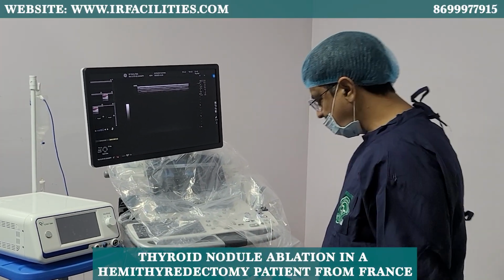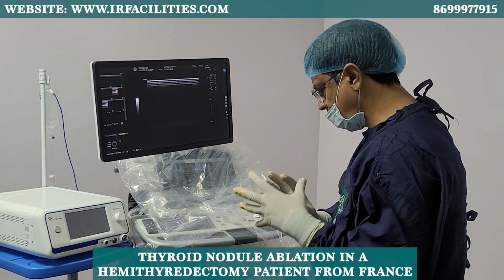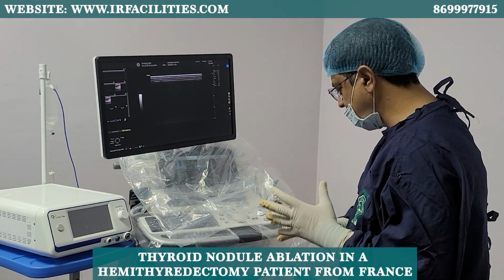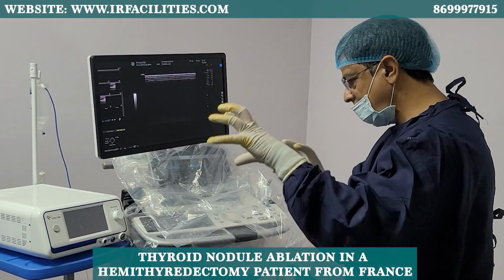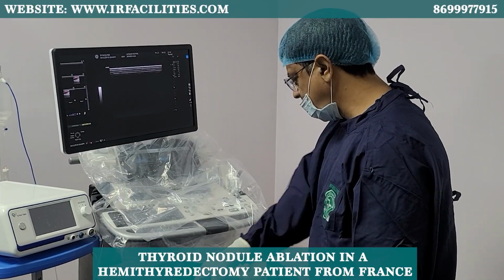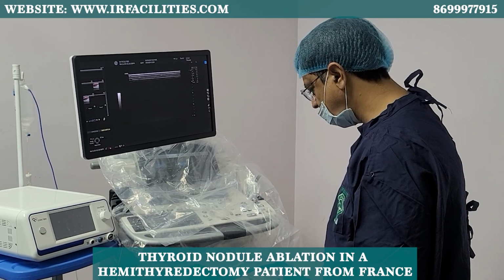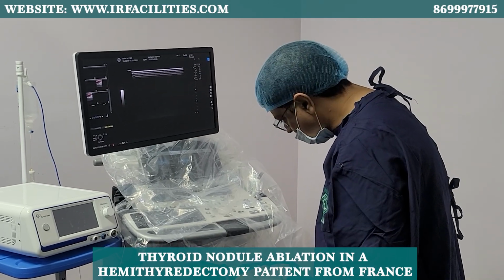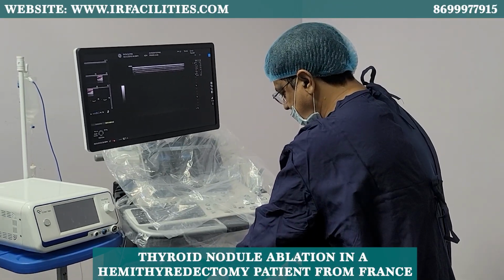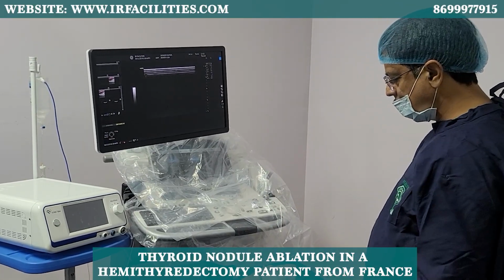See, one is the thyroid, which is of course not normal because of your lymphocytic thyroiditis. There is inflammation in it, so it has become a little coarse. But in that there were nodules. So the nodules we have done, and the part of the thyroid which was going down, that I did last, because it should not go down. It should go inside. Even for a person who has a very big one, you can finish it in one session. Sometimes they might require another session some years later, but by and large one session can be done, even for large thyroids.